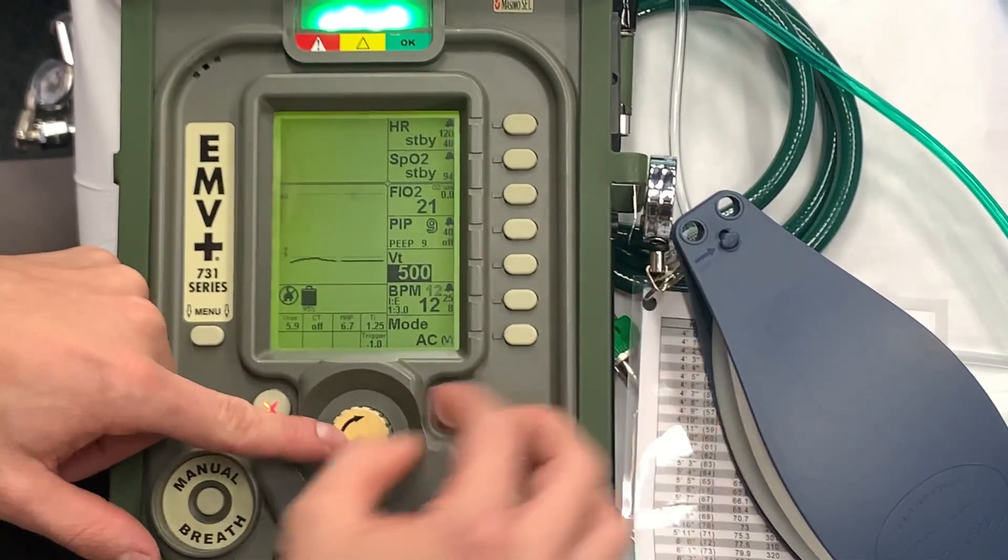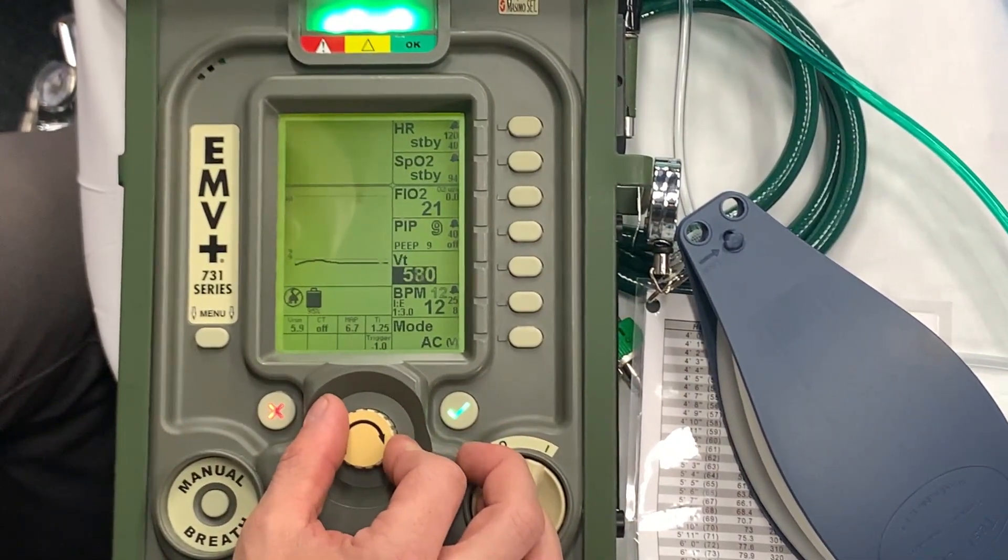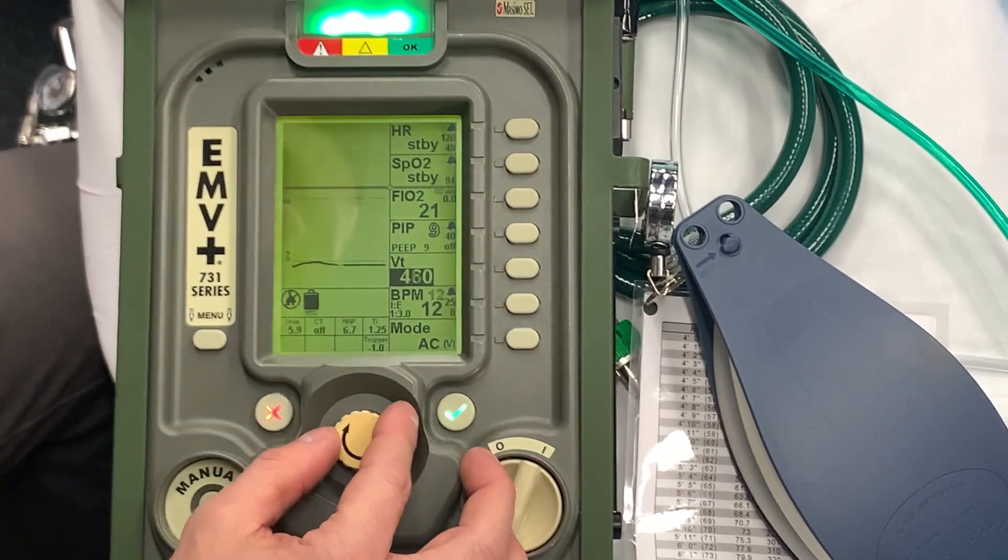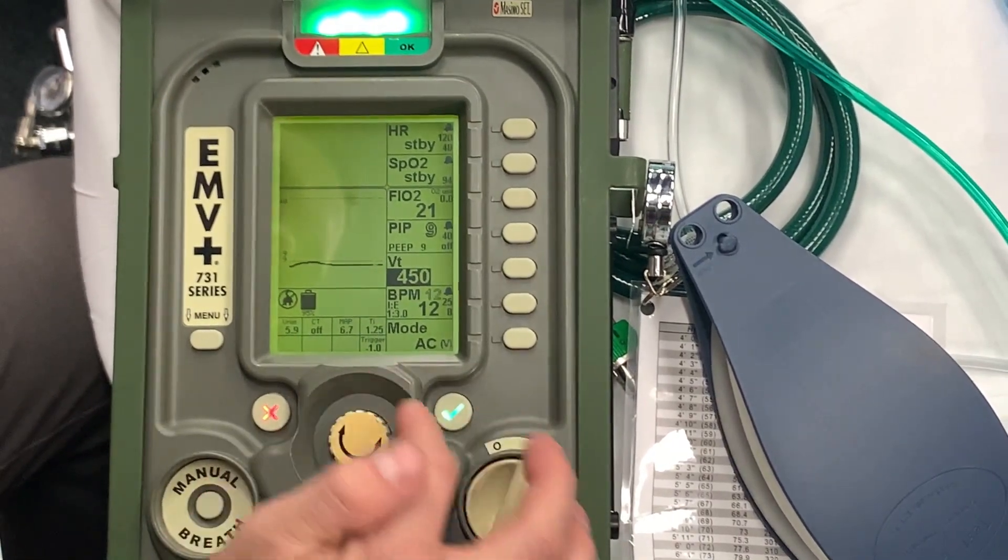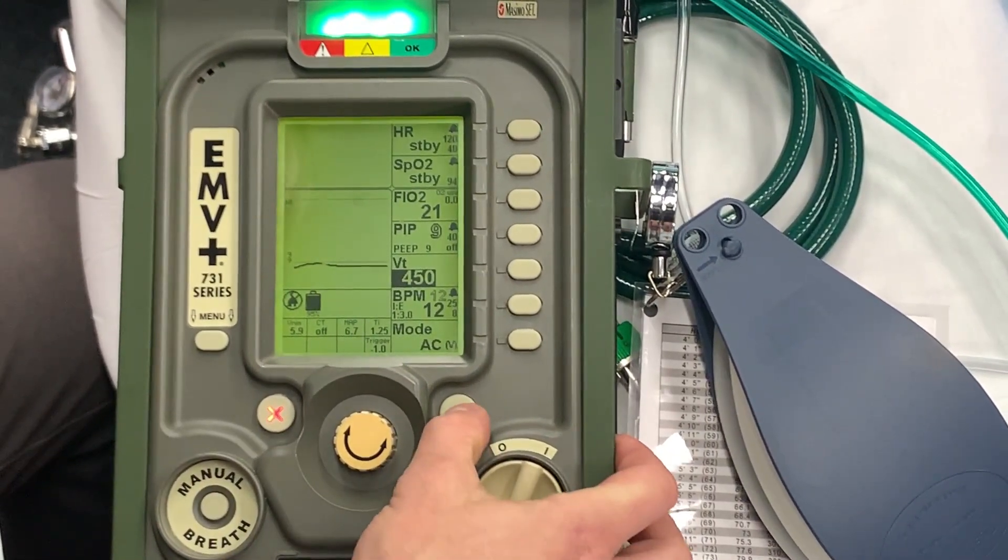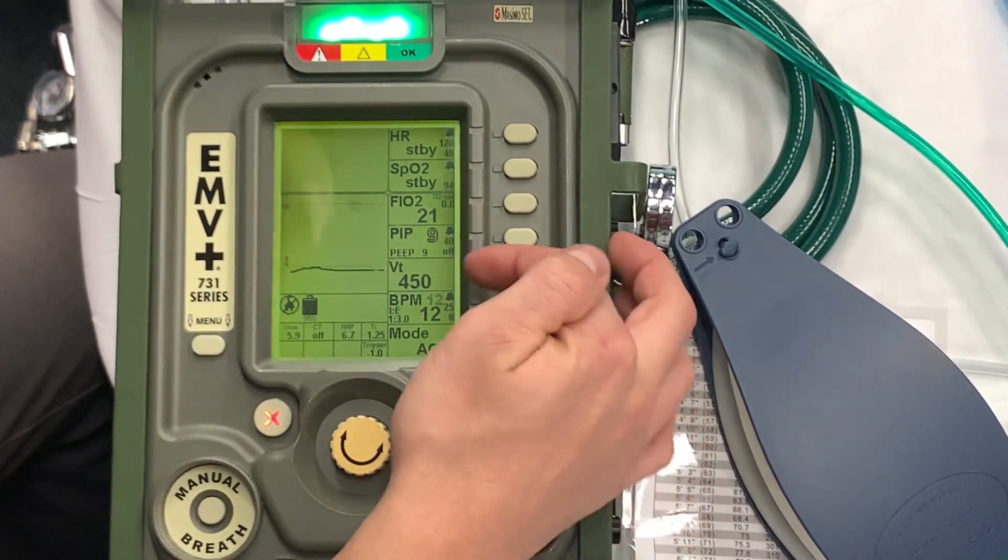There's only one selector knob. So I can go up and down. If I want to do a tidal volume of 450, select 450, and then I have to confirm it with the green knob here. So you can see that 450 is now selected.